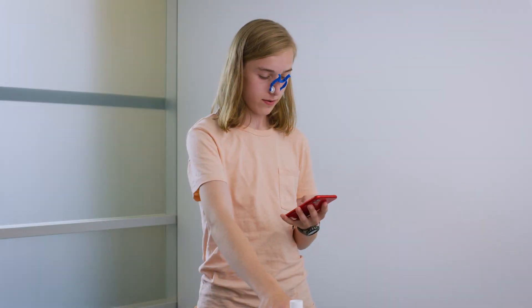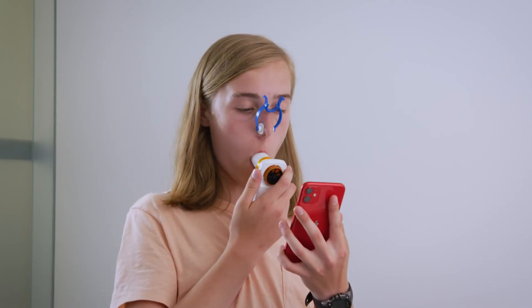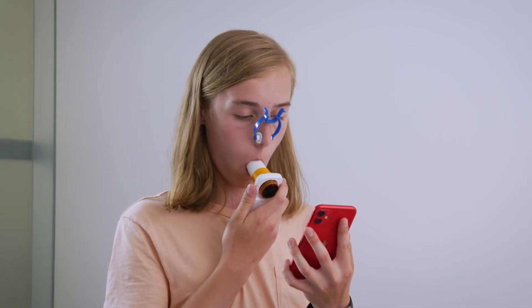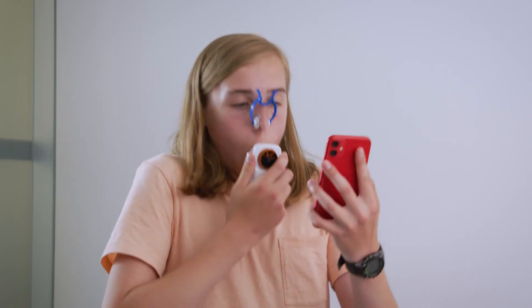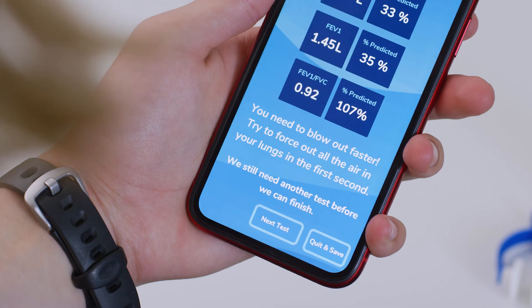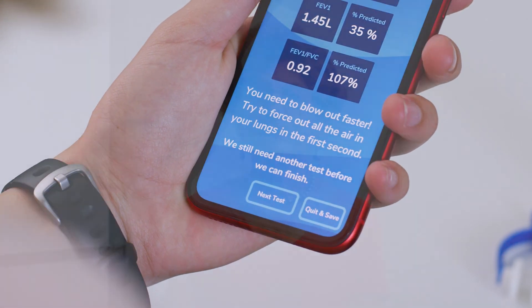So let's do another test whenever you're ready. Looking at the results, that wasn't a good test — we won't worry about that. Remember, the app will take care of it. You'll just do another test.